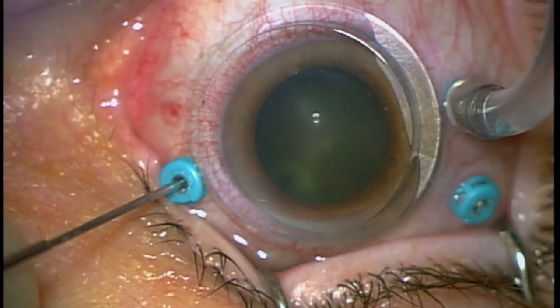Now we're going to look back into the eye. You can see the fine tines of the forceps that I'm going to use to peel the membrane off the surface of the retina.